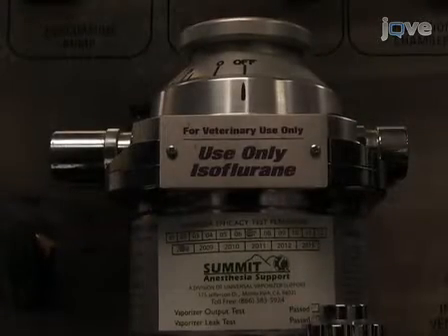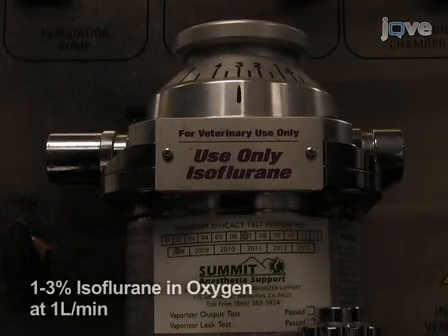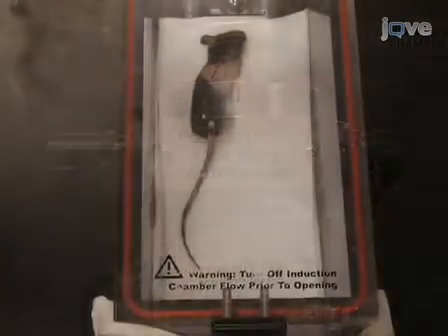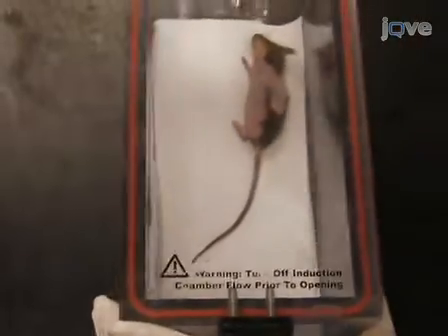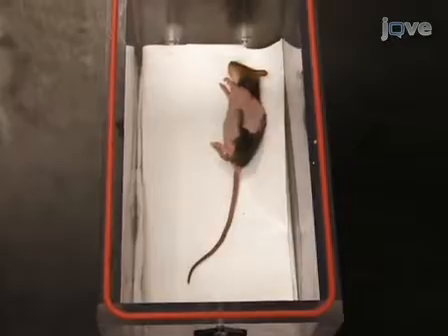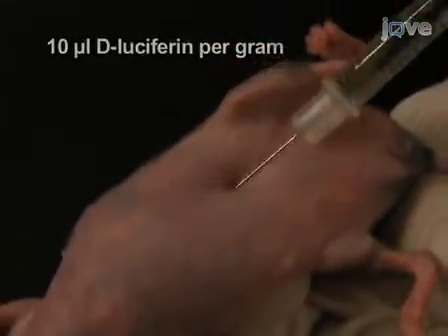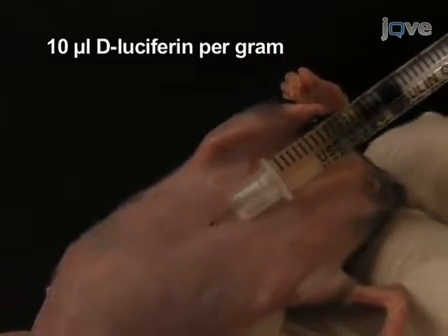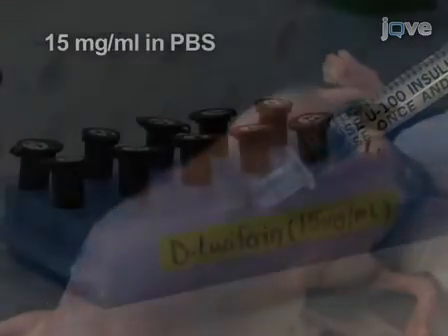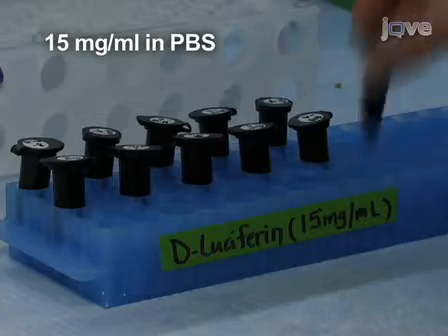Once the imaging box is ready, place the mouse into the anesthesia induction chamber containing 1 to 3% isoflurane in oxygen at output of 1 liter per minute. Leave the mouse in the induction chamber until it is unresponsive to external stimuli. Then remove the animal from the induction chamber. Inject 10 microliters of D-luciferin per gram of body weight into the peritoneum. The D-luciferin is prepared in advance into filtered stock solutions of 15 mg per milliliter in PBS.